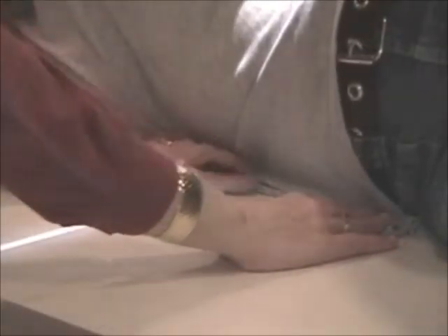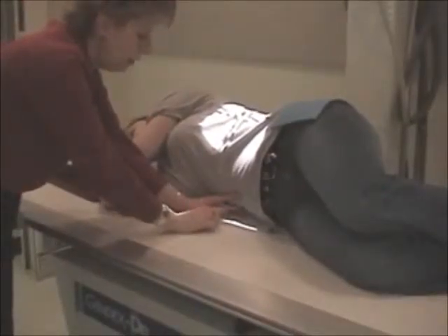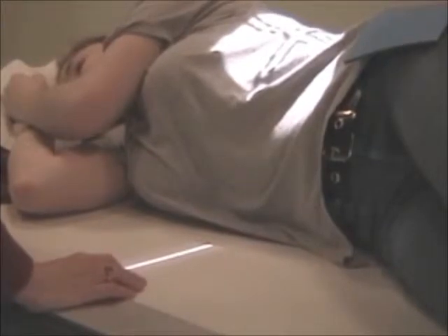And I'm going to have you focus on the tabletop here. When I did that, look what happened. I'm actually X-raying tabletop. I have my 10 by 12 collimated field set with the gauge, and if I'm showing tabletop, I'm giving the doctor no valuable information there. So I'm going to adjust that centering a little bit to give him more of the body, give her more of the body, to see perhaps more of the stomach or small intestines.